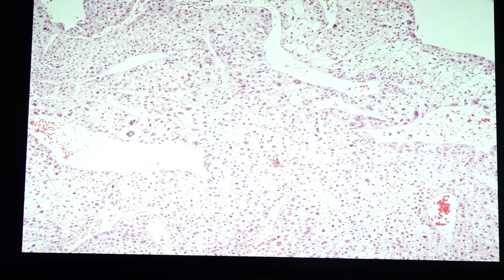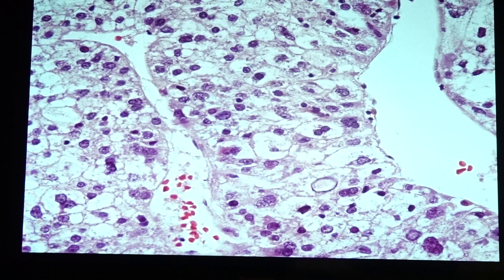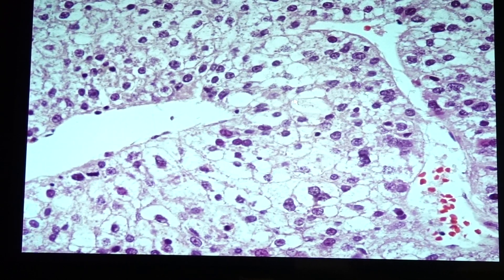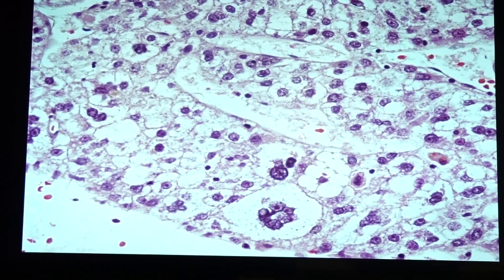In the slide we see atypical cells forming trabecular sheets. The sinusoids are visible, but notice the thickness of the trabecular sheets — in normal hepatic architecture each trabecular sheet contains up to three hepatocytes, but here it is more than three. The trabecular plate is very thick, and there is variation in the size of the nuclei.